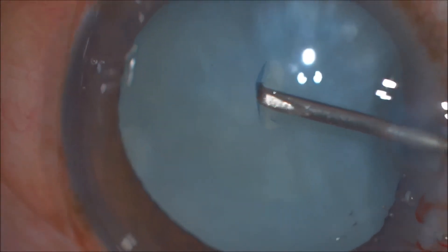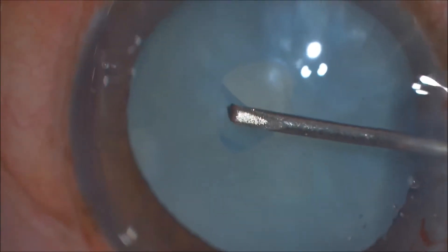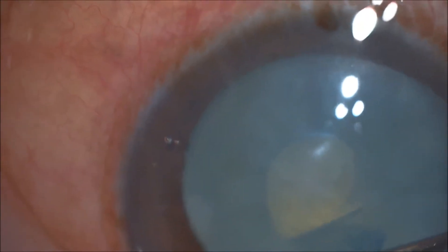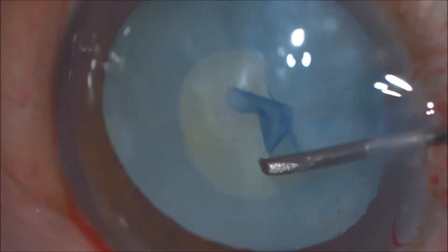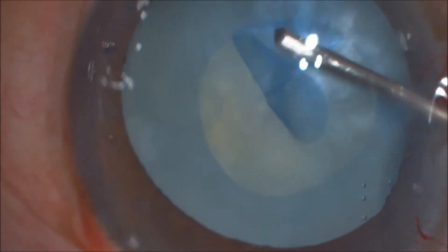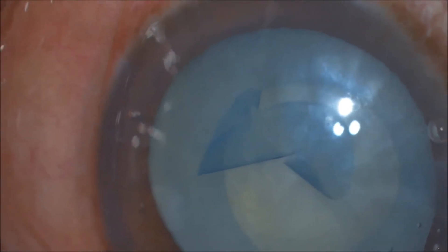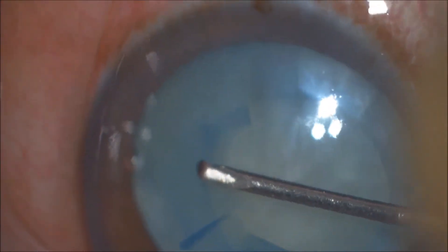This is a case of a mature cataract with an elastic capsule in a young diabetic patient. The surgeon makes an initial rhexis of about 3 mm, and once 270 degrees is completed, it is expanded to a second rhexis — what we call a double rhexis — of about 5 mm in diameter, with constant visco top-up to keep the anterior chamber formed and prevent the rhexis from running away.